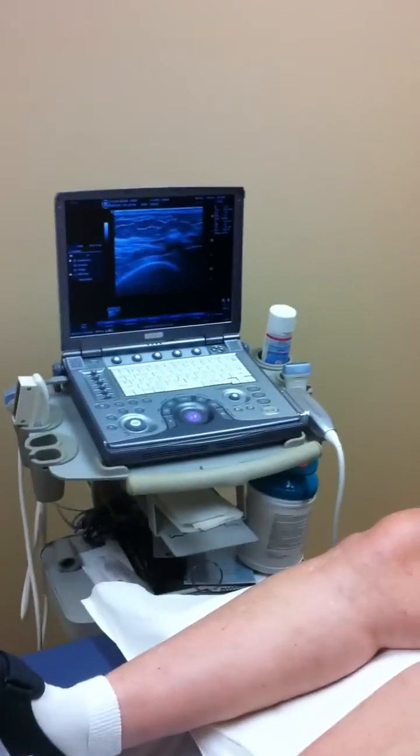Hi, Ms. Clark. This is Dr. Jabor. We just finished injecting your knee by using the ultrasound to help guide our injection into the knee.